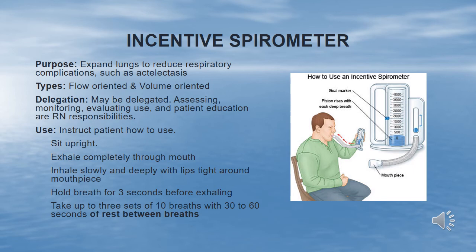Helping patients use incentive spirometers may be delegated to a nursing assistant. The assessment, monitoring, and evaluation of the use of the spirometer is the responsibility of the RN. Patient education and the use and evaluation of the teaching is also the responsibility of the nurse.